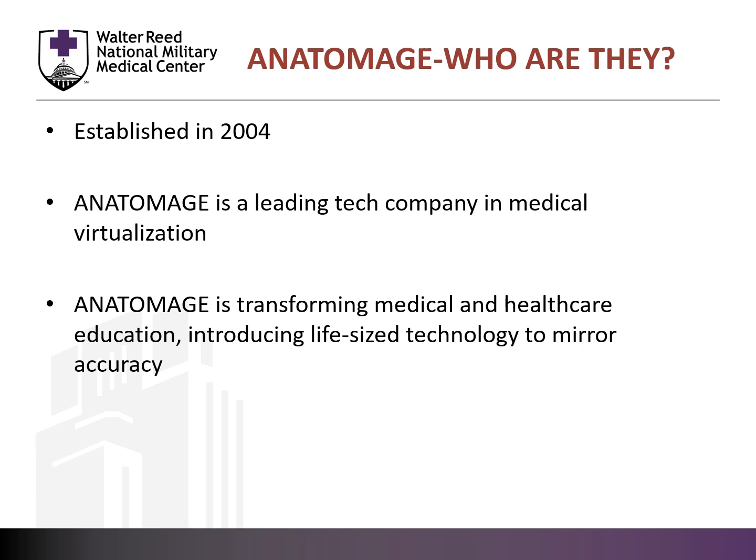The company, Anatomage, was first founded in 2004, and for close to 2 decades has been improving their software and technology to bring detailed anatomic models to the anatomy lab, classroom, operating room, and simulation center. It can be placed virtually anywhere.